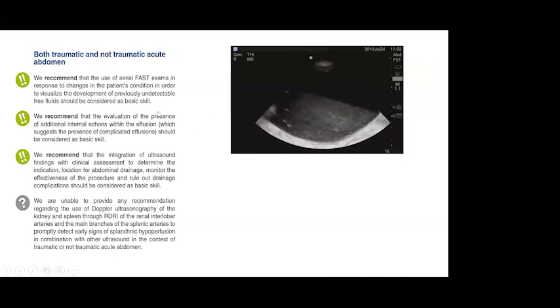So for instance, if a patient has come back from a renal biopsy or a hepatic biopsy and is deteriorating, you just put the probe and see there is a fluid-dense area. This is the fluid, the hyperechoic area, and this is a hypoechoic area. So likely this is the cause of the deterioration, the hemodynamic instability. There's an acute hemoperitoneum. This sign is called the hematocrit sign.